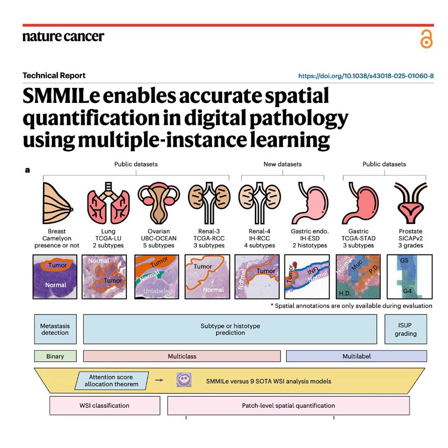It really is. In the lung dataset, these contentious patches were sitting right on the tumor margins, the absolute frontier between healthy tissue and cancer. The original human annotator hadn't colored them in. They thought it was safe, but SMMILe flagged them as positive. And the verdict? When the senior expert reviewed them under extreme magnification, they confirmed SMMILe was right. Wow. The patches contain highly suspicious, undifferentiated tumor cells hiding deep in the stroma. The human eye had simply glossed over them due to visual fatigue. The machine caught what the human missed.